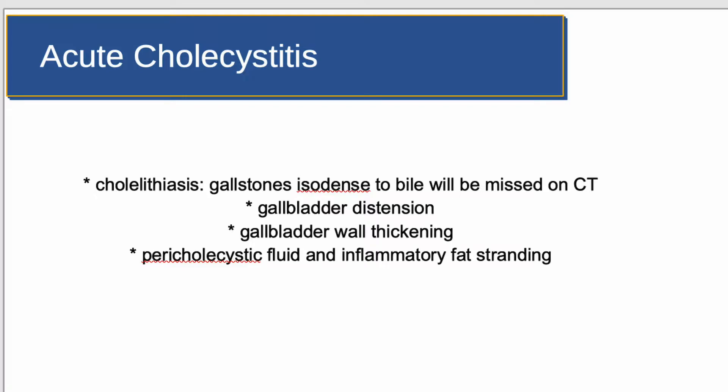CT is a useful tool for the diagnosis of acute cholecystitis, which refers to acute inflammation of the gallbladder. It is a primary complication of cholelithiasis and is the most common cause of acute pain in the right upper quadrant. Acute cholecystitis is a common cause of hospital admission and is responsible for approximately 10% of all patients with abdominal pain.